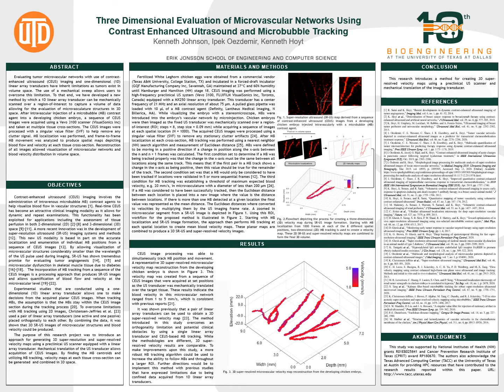Validated microbubble locations were placed into a new image with the values being the Euclidean distance between locations. If more than one microbubble was detected at the same location, the final value was represented by the mean distance. Finally, the distances were multiplied by the frame rate to create the velocity maps at each tissue cross-section. These planar maps are combined to produce 3D super-resolved ultrasound velocity images.